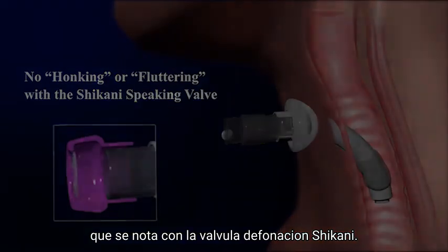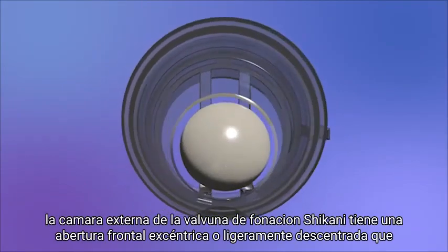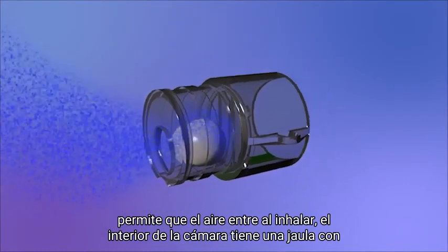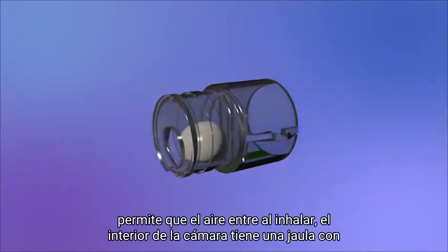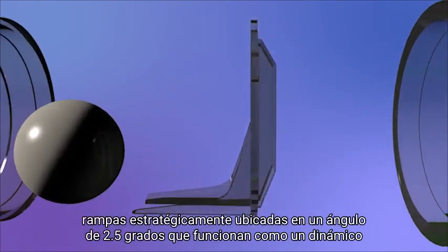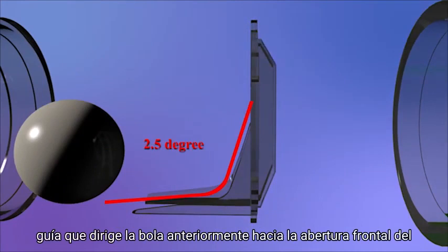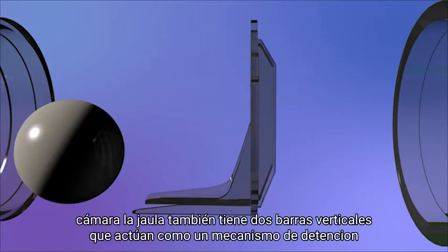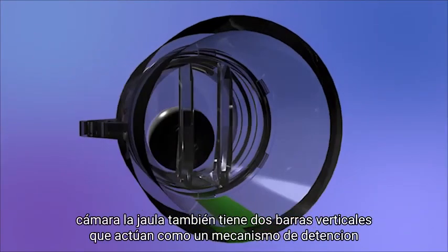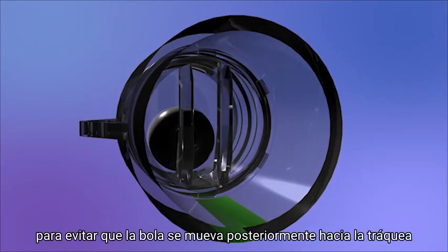The outside chamber of the Shikani speaking valve has an eccentric, or slightly off-center, frontal opening that allows air to enter upon inhalation. The inside of the chamber has a cage with strategically positioned ramps at a 2.5 degree angle, which function as a dynamic guide that directs the ball anteriorly towards the frontal opening of the chamber. The cage also has two vertical bars which act as a stop mechanism, preventing the ball from moving posteriorly towards the trachea.